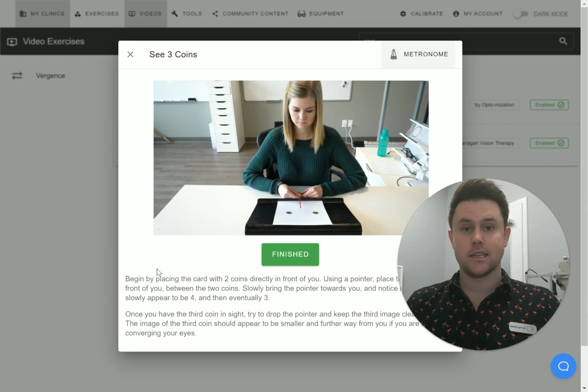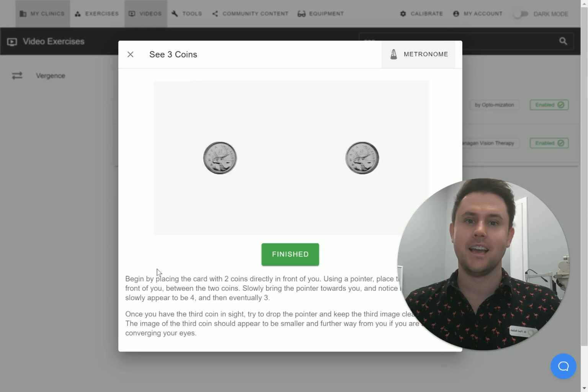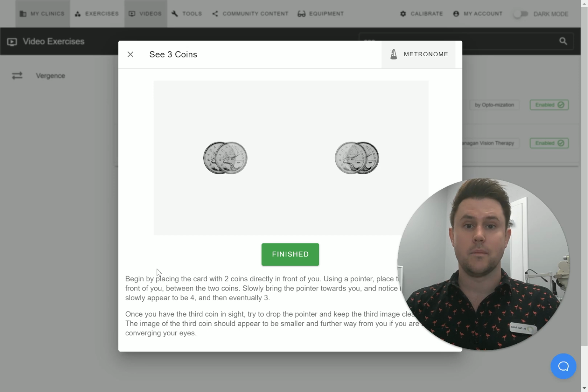You're going to bring your eyes in and converge while looking soft to try and get a sense of that feeling of how to converge your eyes, how to bring your eyes inwards. And as you can see, this is where people often get stuck. They have a hard time seeing if there's more coins in the background.